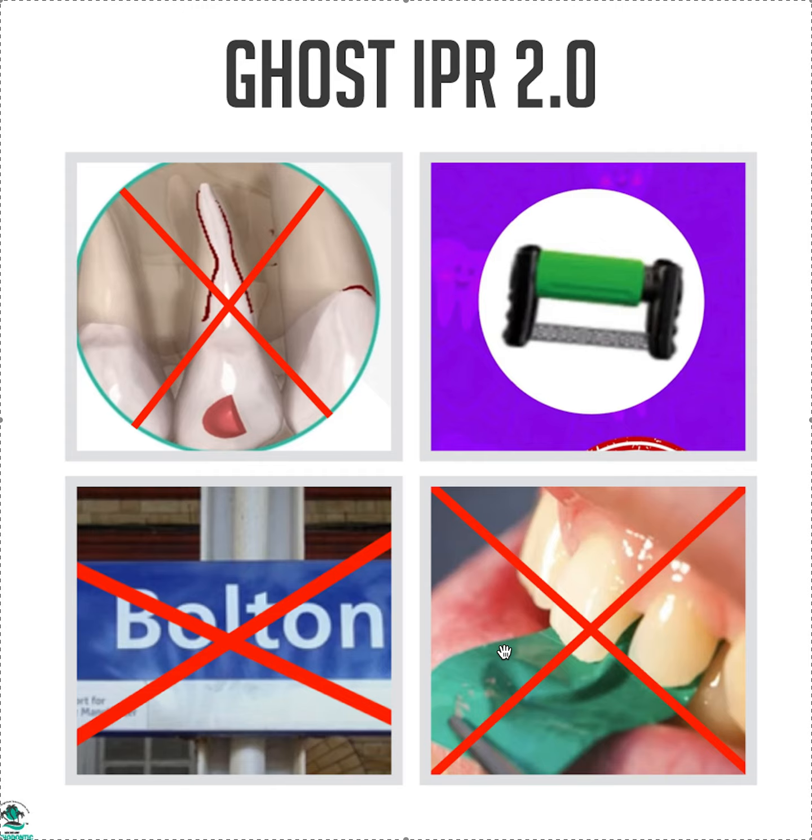Then you ask, can I please have 0.1 millimeters IPR on the following sites? Only if it did not pick up the space. Then you do not do that IPR. You do not tell them it's Ghost IPR, you just ask for it. You've got to write it down, and then bingo, you should be money when this is done. Really easy, super fast, quick fix, just a few aligners. That is Ghost IPR. All right, thanks.